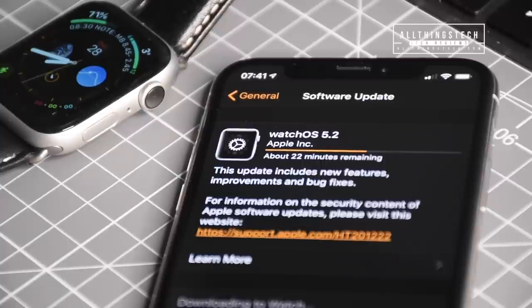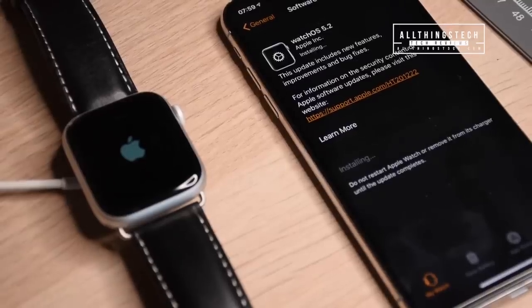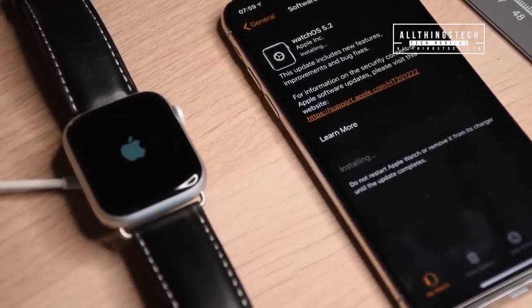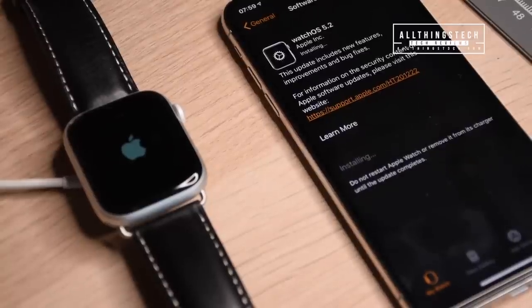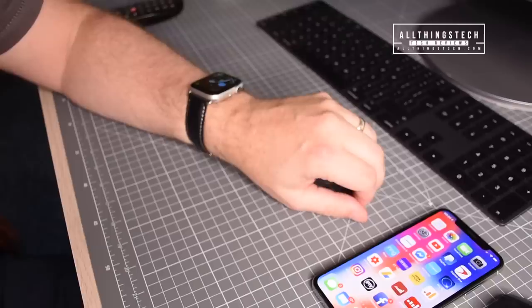Let's show you how to get this working on your device. Make sure that you've downloaded the latest software update, which currently is watchOS 5.2 — it may be a later version depending on when you're watching this. Download and get that installed on your device; it will take a few minutes.